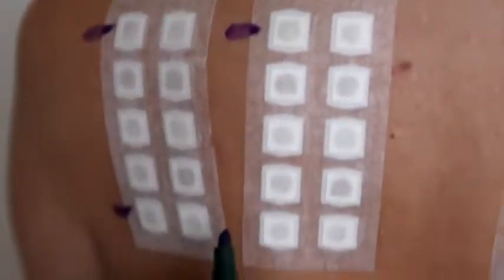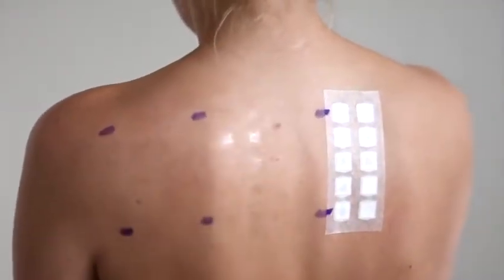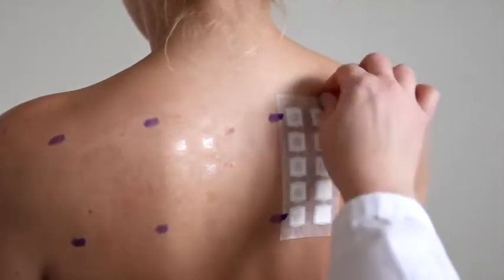Mark to the left of the tape the first and the fifth chamber using the Chemo Skin Markers. After about 48 hours, remove the patches with a rapid diagonal motion to minimize patient discomfort.